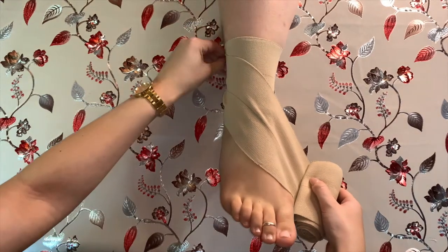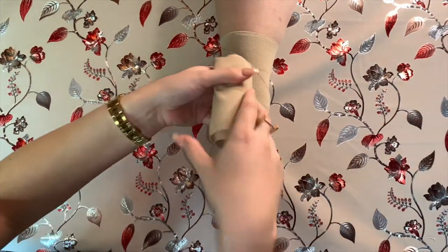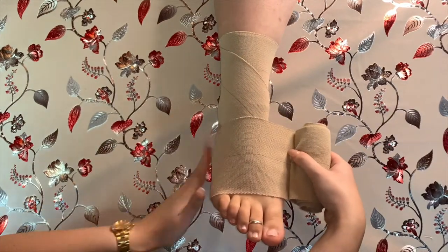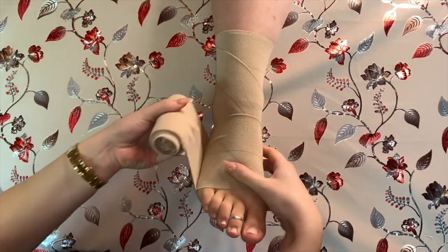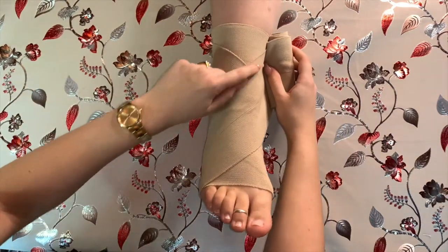After the second wrap, bring the bandage down towards the toes on the side of your dominant hand, wrapping it underneath the ball of the foot and smoothing out the creases as you go. Anchor it at the bottom by wrapping it horizontally at the toes. Once it's wrapped all the way around, bring the bandage back up towards the calf.